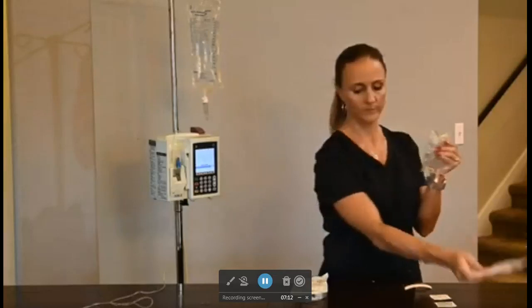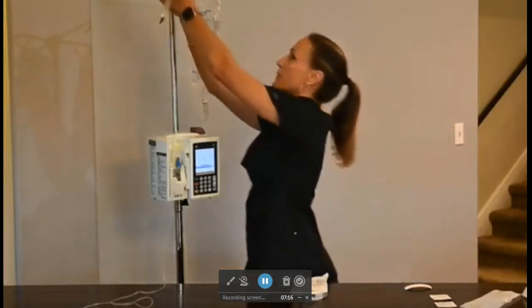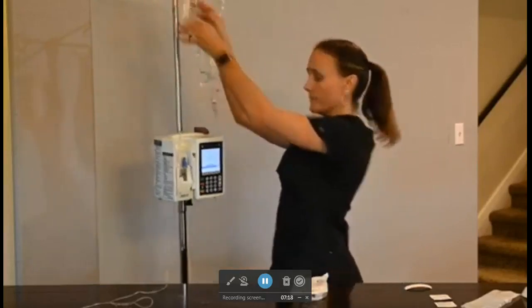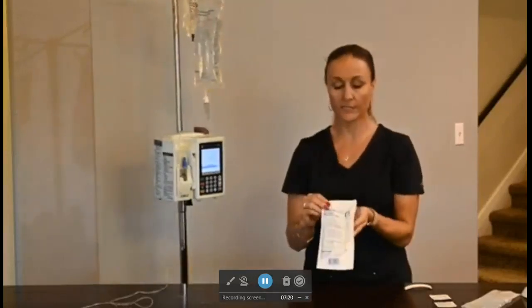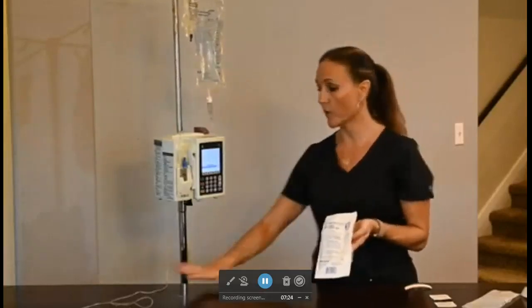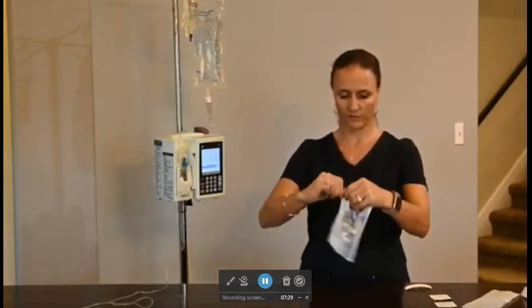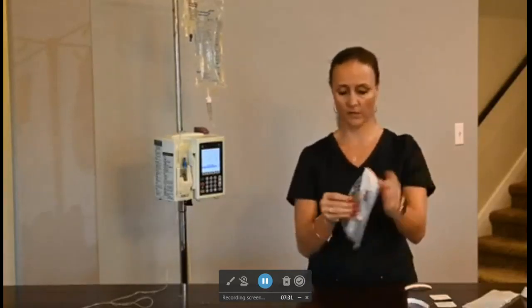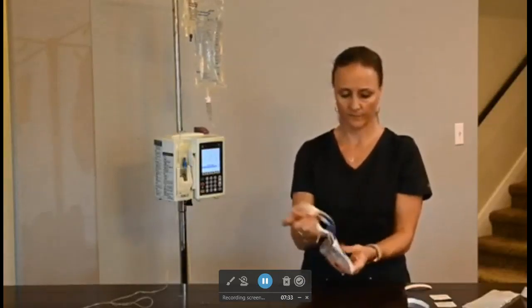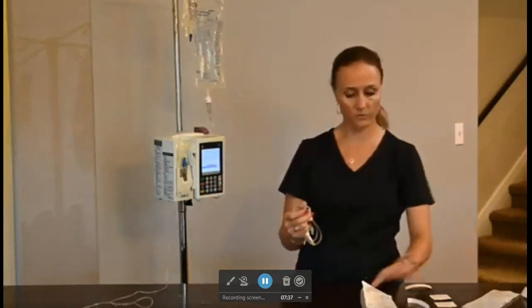I have my primary fluid already running. Then I'm going to come and hang up my piggyback. I'm going to get my secondary tubing. Secondary tubing is shorter than primary tubing. Again, find the little bridge. Opens a lot easier that way. With the plum pump, you don't need the hanger, so just discard that.